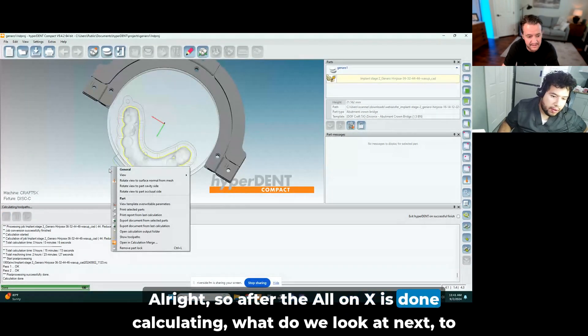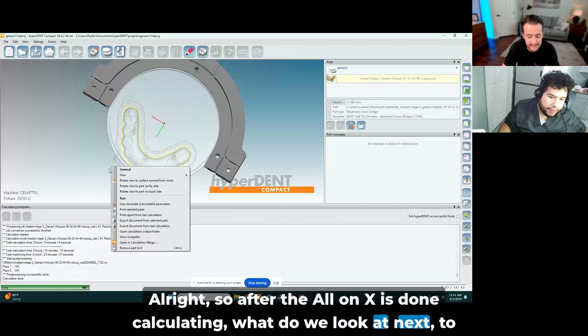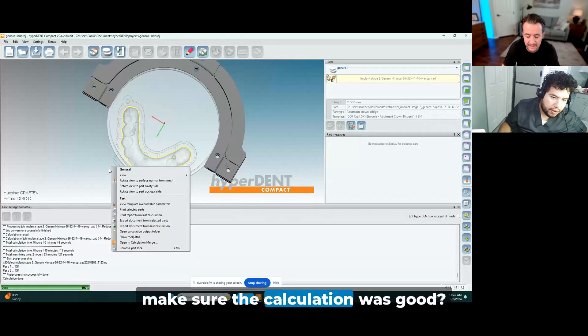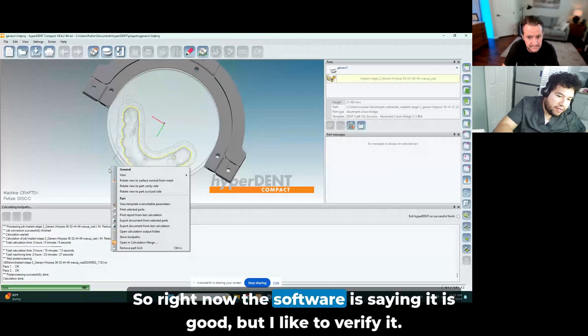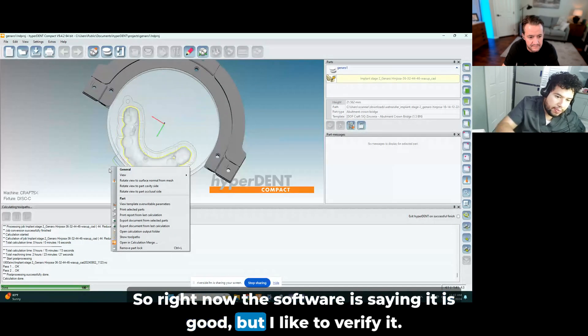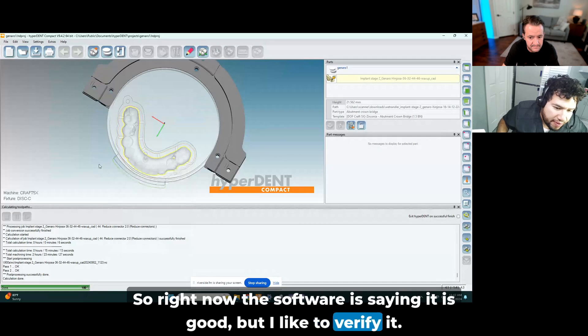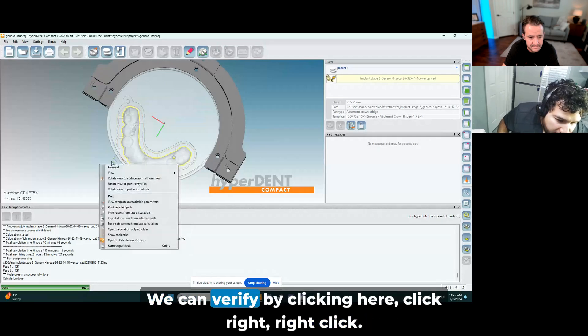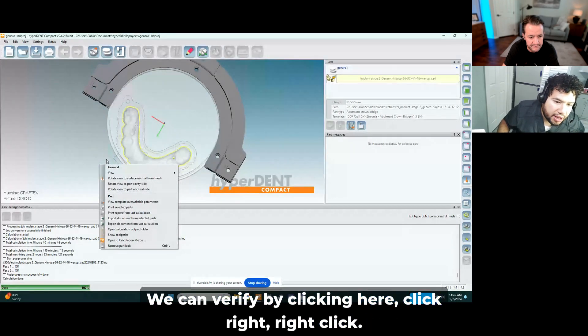Alright, so after the All-On-X is done calculating, what do we look at next Harrison to make sure the calculation was good? So right now the software is saying it is good, but I like to verify. We can verify by clicking here, click, right click.